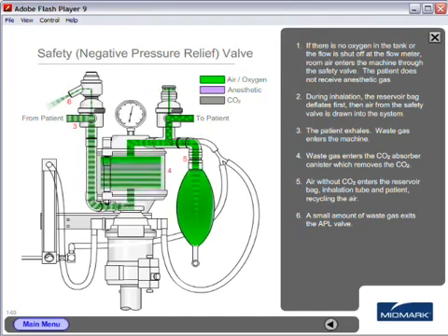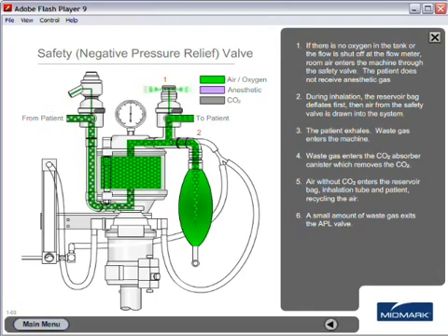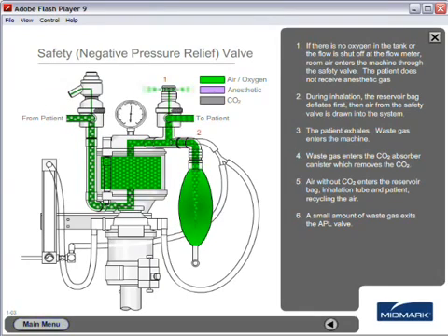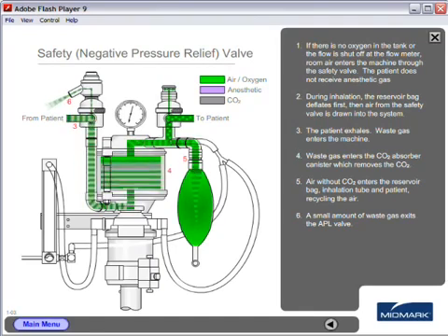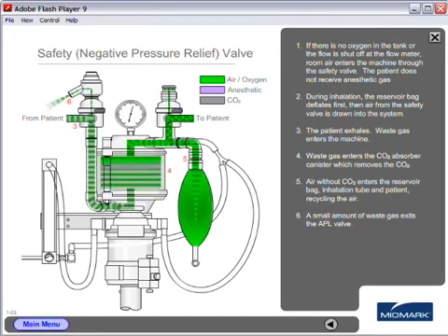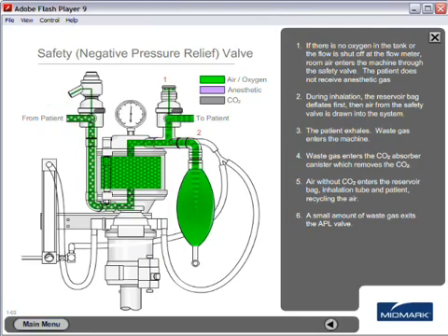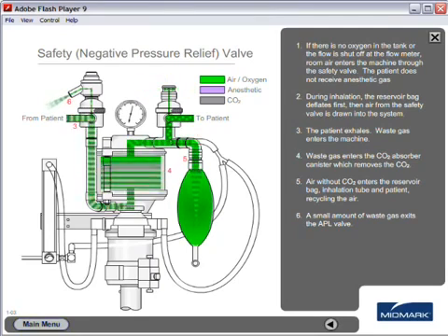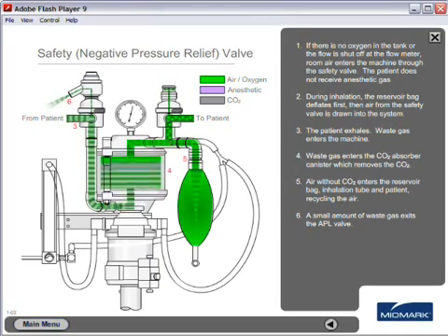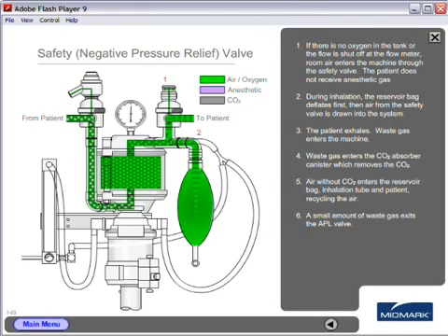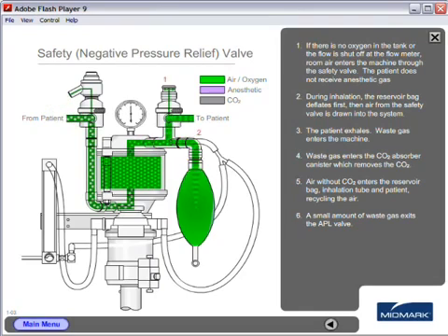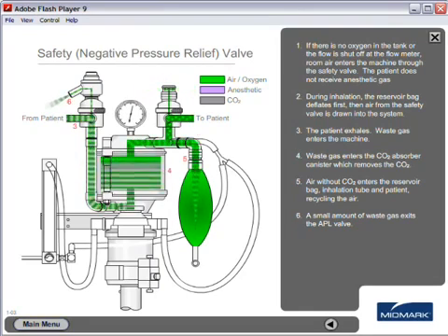Number three, the patient exhales and waste gas enters the machine. Number four, waste gas enters the CO2 absorber canister which removes the CO2. Number five, air without CO2 enters the reservoir bag, inhalation tube and patient, recycling the air. Number six, a small amount of waste gas exits the APL valve.